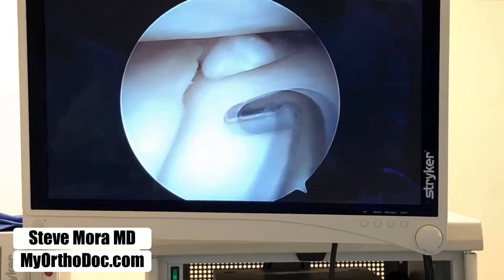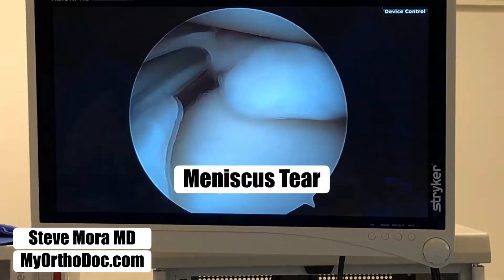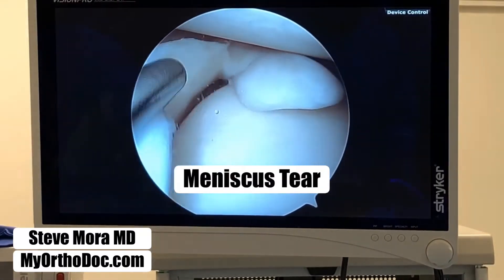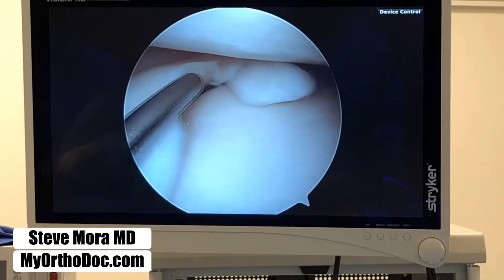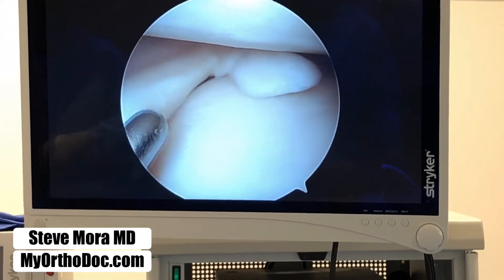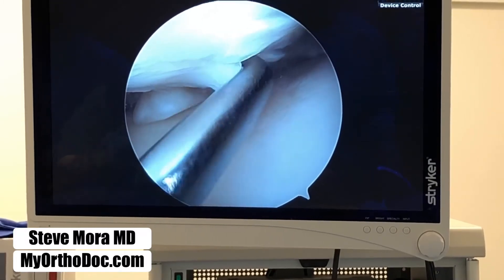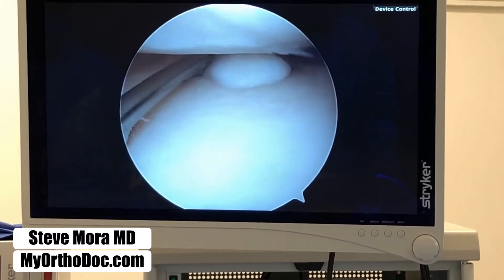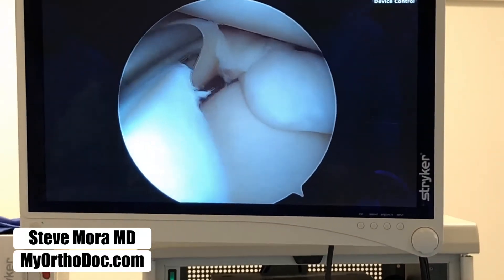This is why this gentleman has so much pain — voila! Look at that big piece of meniscus that was hiding in that crevice right there. Very, very painful looking meniscus, and it indeed was painful. So all I'm going to do here is trim this meniscus tear — it's called a partial meniscectomy. I'll smooth this cartilage out a little bit. This is what was causing the patient's pain. That is a pretty ugly looking meniscus tear, and it was hidden in the coronary recess.